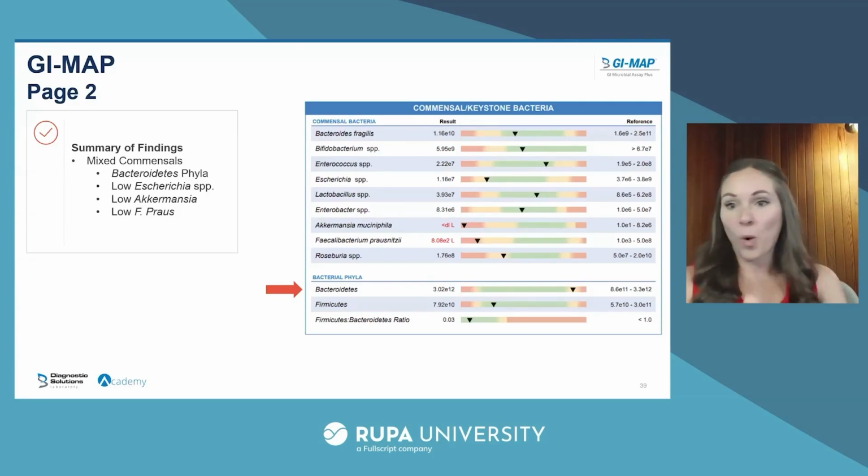We're going to see that slightly elevated later on in the StoolOMX, and it's likely coming from here. And why are things overgrowing? What's creating a favorable environment is usually weak digestion. So that's where I was pointing out that stress piece. Stress really decreases our stomach acid, and that's going to change the environment, making it more favorable for overgrowth lower down. So that's where that comes in.